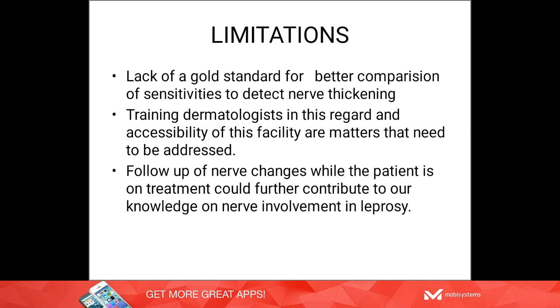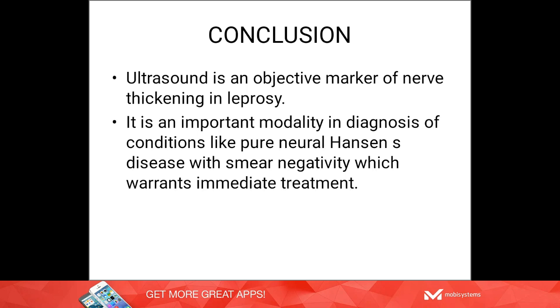Coming to limitations, lack of a gold standard for better comparison, like a nerve conduction study per se, is one of the drawbacks of this study. And training dermatologists in this regard and accessibility of facility of ultrasound are matters that need to be addressed, especially in resource poor countries. And follow-up of the nerve changes while the patient is on treatment could further contribute to our knowledge on this aspect.